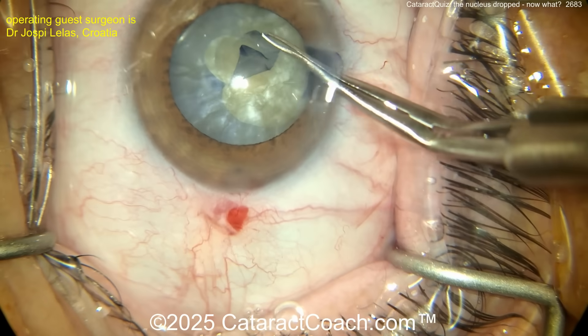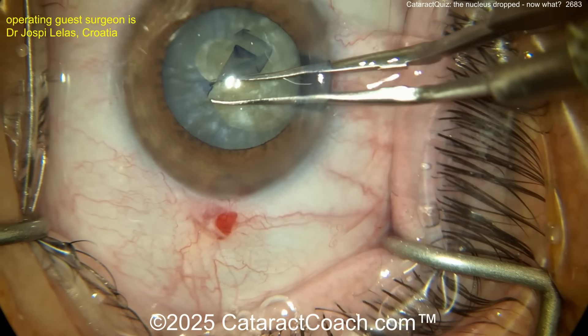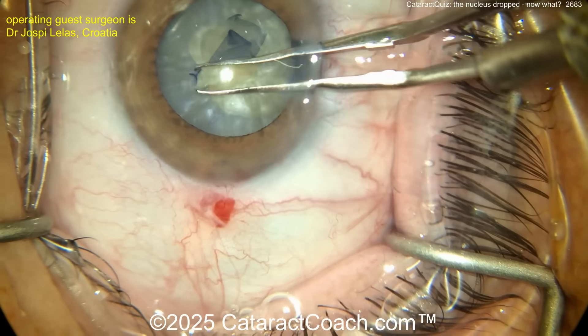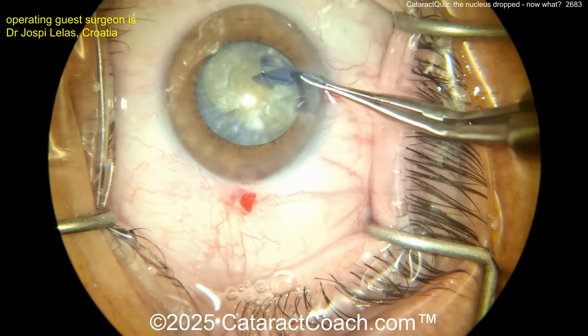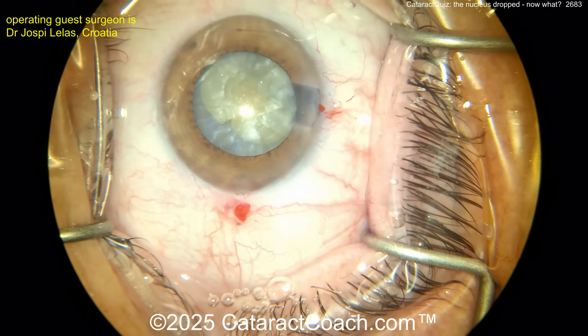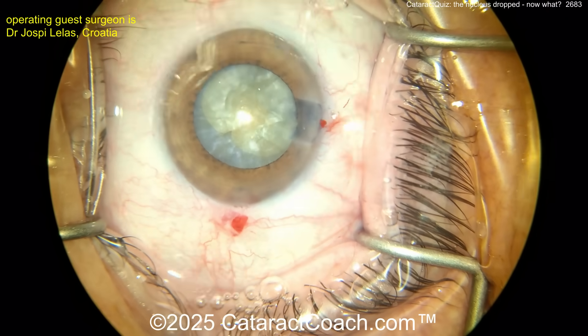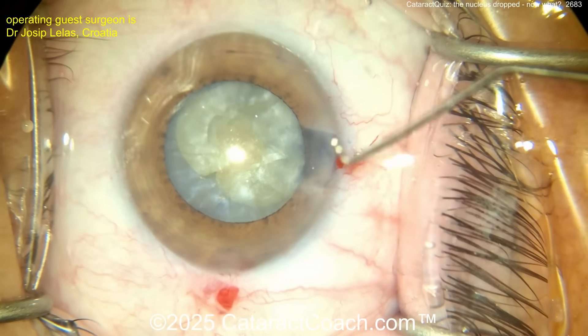Go around the other side perhaps, and get that rhexis enlarged this way. That looks pretty good, but you've got one area where the rhexis ran out. Not sure if you were able to capture that with the clockwise rhexis, but we're going to find out.